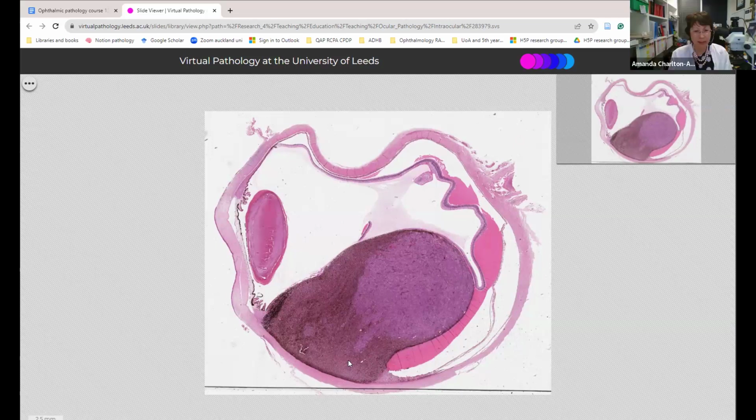How do you know it's melanoma? Well, I know it's a melanoma because it's got brown pigment in it, and realistically, there's only one tumor that has brown pigment in it. Now, some melanomas in the eye don't, do they? That's right. There's a clone here that's growing in this melanoma that looks more amelanotic than the rest. I actually quite like it when they're amelanotic, they're easier to see. So this has got dark chocolate on the outside and like white chocolate here.